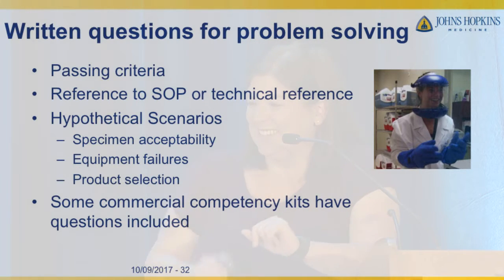So you should always reference these questions to your SOPs or to other technical references so that you have something to go back to. So my answer key, I literally write down where I got the answer from.